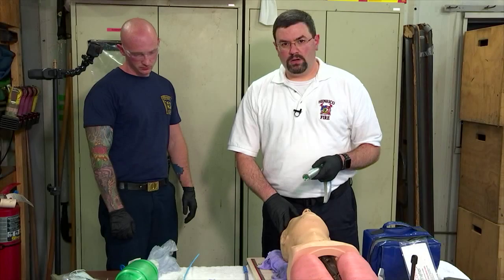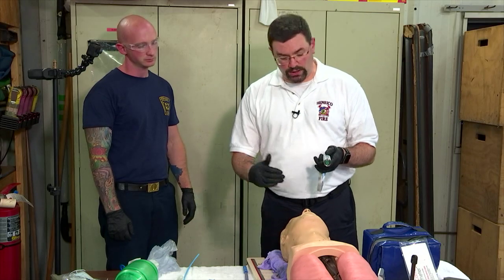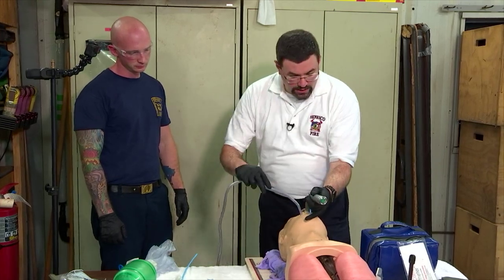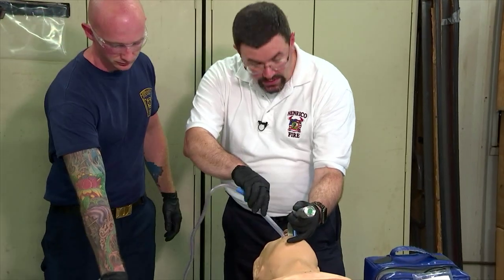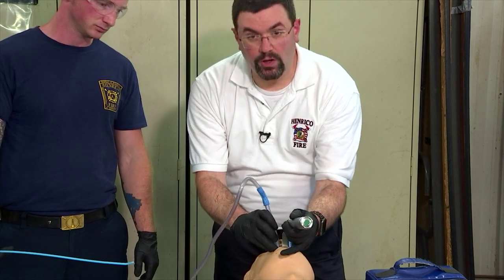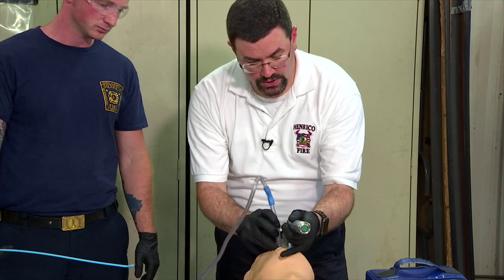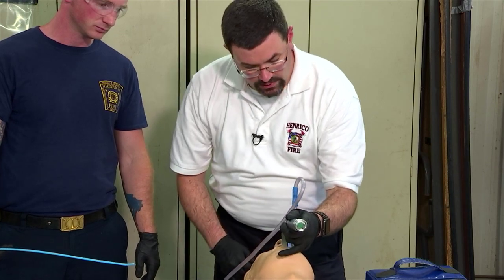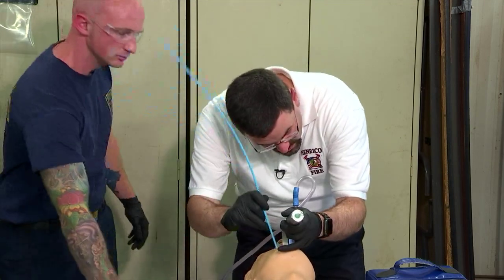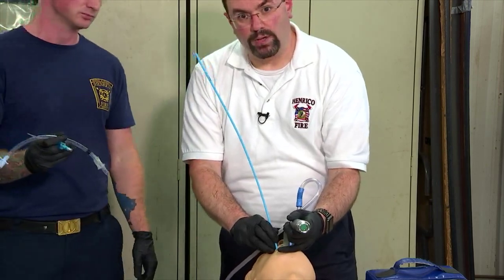Good. Just to re-demonstrate the actual suctioning technique and the idea of parking, I use whatever intubation blade I'm going to be using to get my view as I'm going in. I suction just like normal until I can identify and see the cords. Then I'm going to put the tip of the DuCanto suction catheter into the opening of the esophagus, so I'm behind the cords, and then switch hands. I'm moving the suction catheter behind the intubating blade, and I still have my view of the cords. Then I can easily advance my bougie through the cords without the suction catheter being in my way.